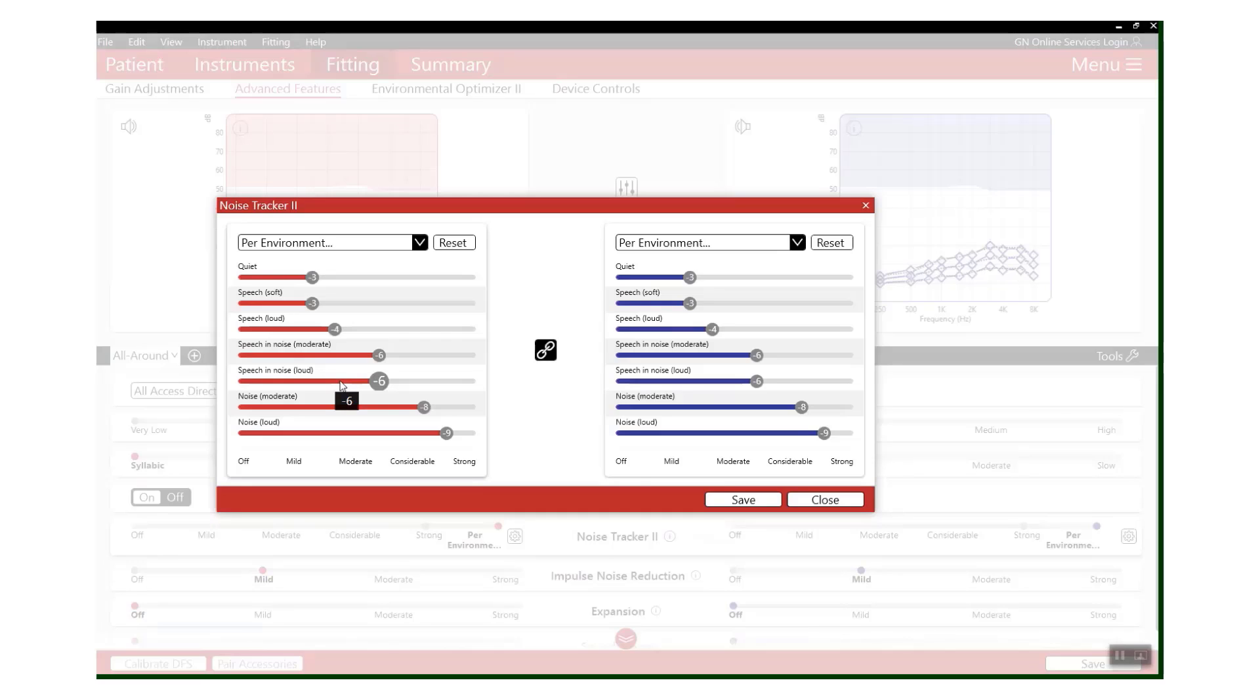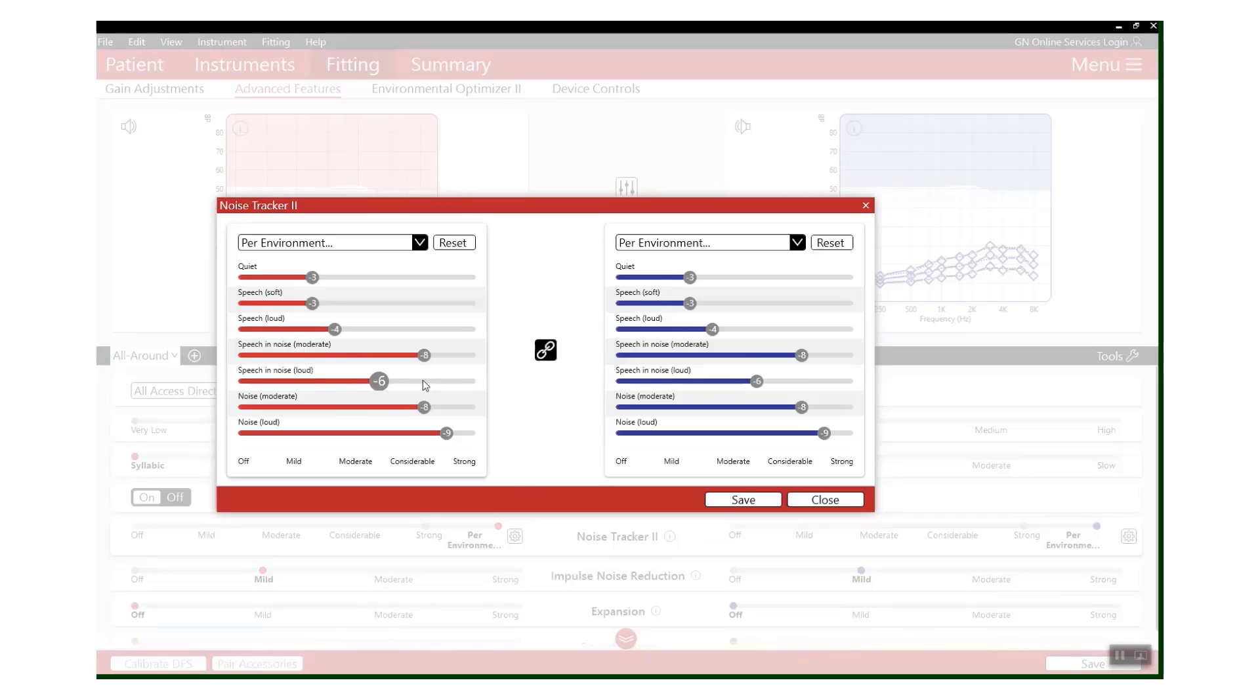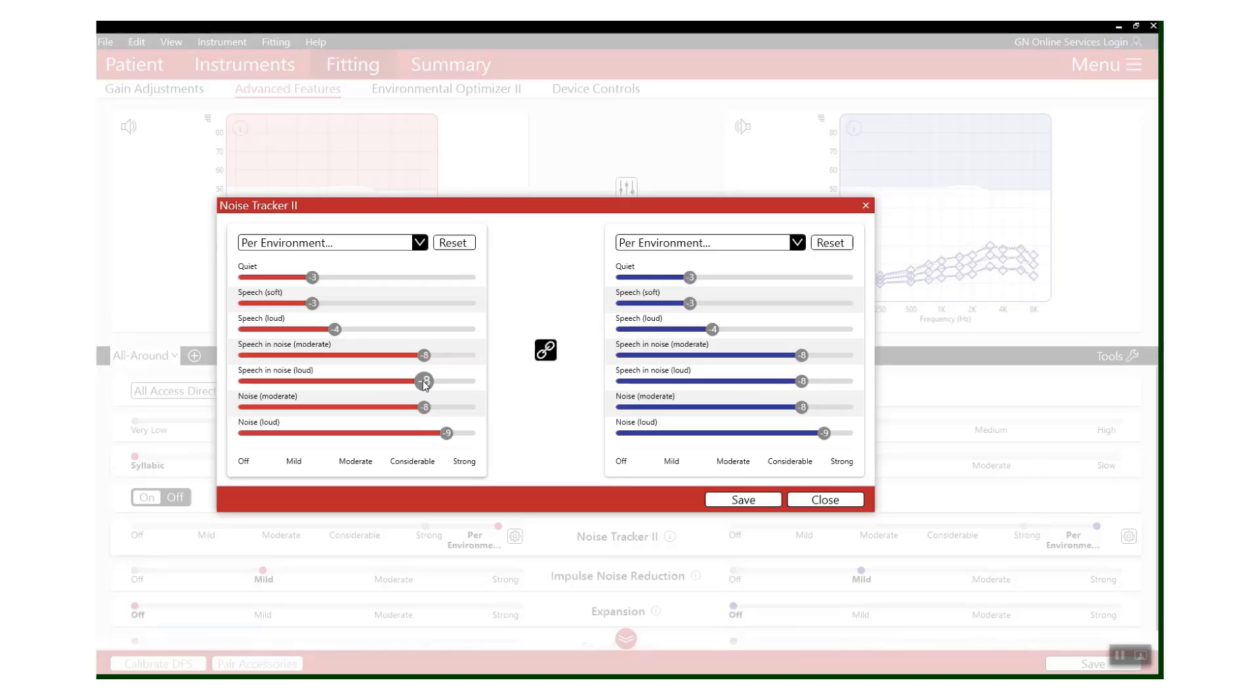So let's increase those sliders by 2 dB, and thus increase the amount of noise reduction that is applied in those two environments up to a strength of 8 dB. Now if we think about what's just happened, our first step was to increase the gain - we turned up both that background noise and that speech depending on that environment.